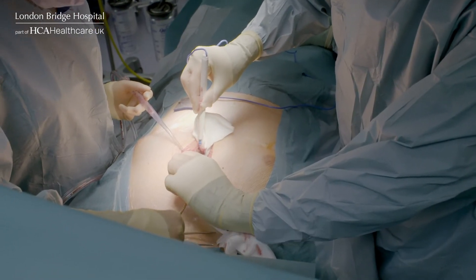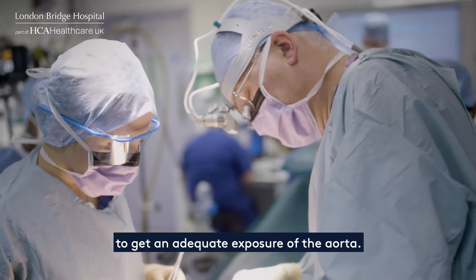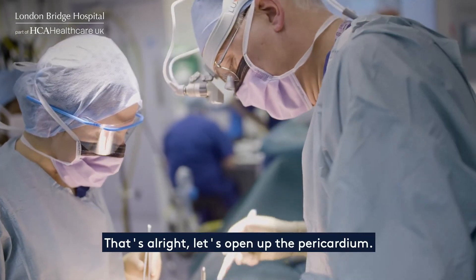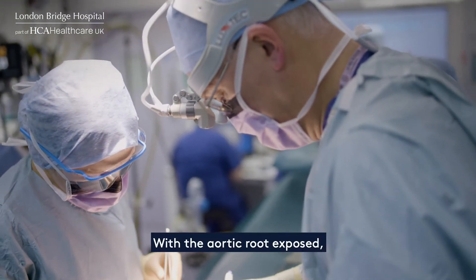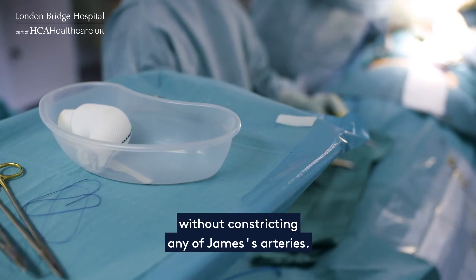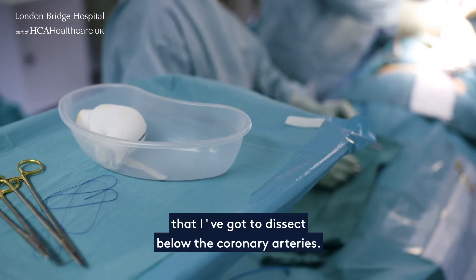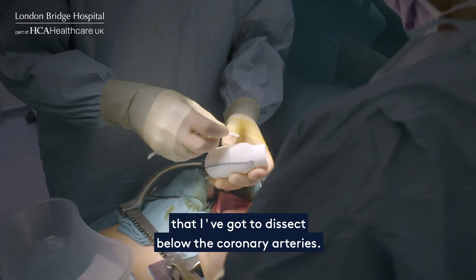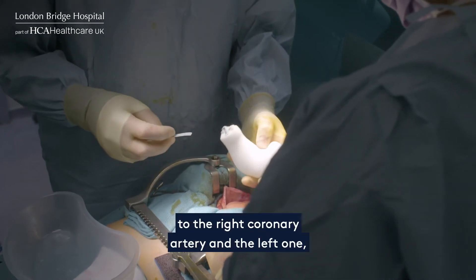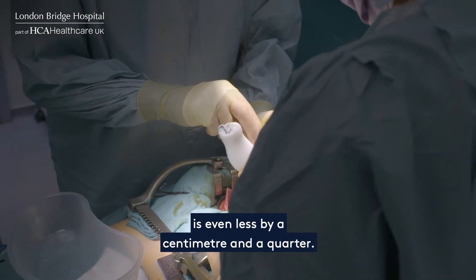That's the chest open. You just have to do a little bit of preparation to get in and get adequate exposure of the aorta. Let's open up the pericardium. With the aortic root exposed, the surgeon must now ensure the graft fits perfectly without constricting any of James's arteries — just working out the height to dissect below the coronary arteries. It's about a centimetre and a half for the right coronary artery, and the left one is even less, about a centimetre and a quarter.